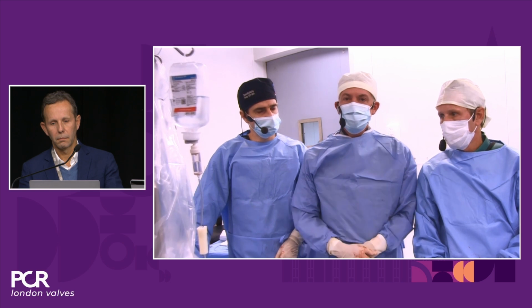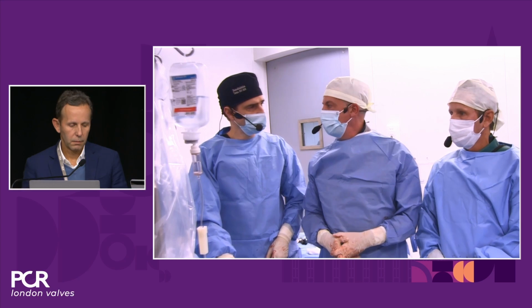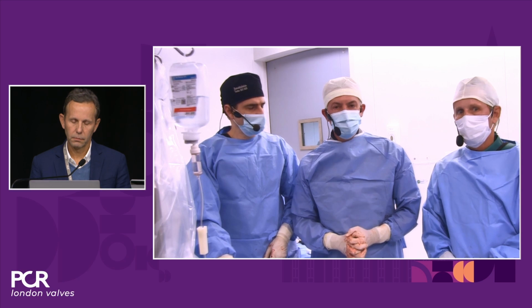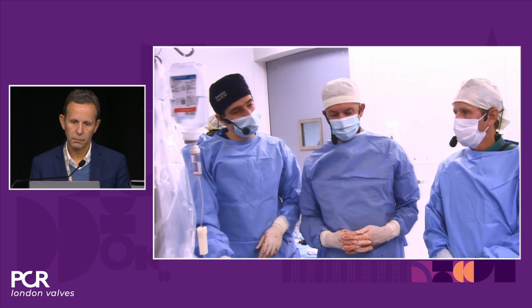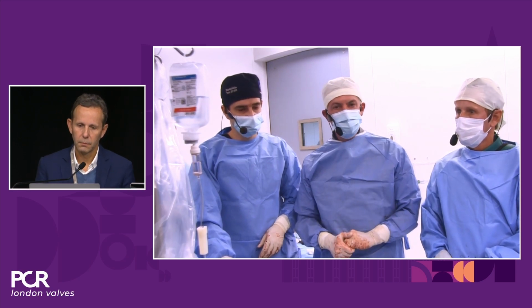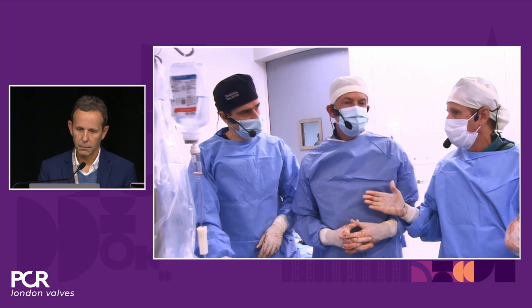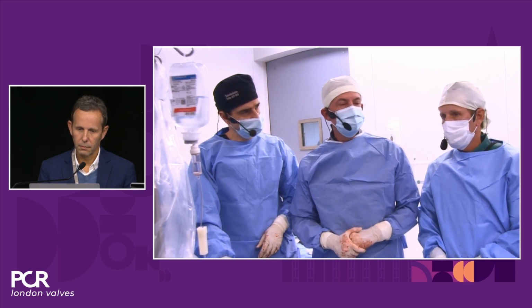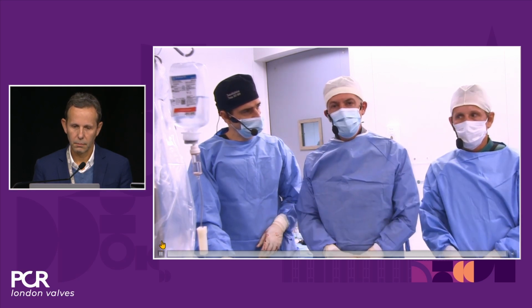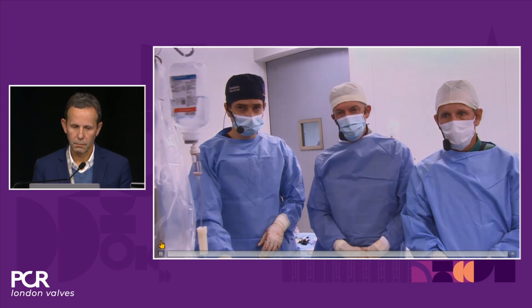And I have to say that this was a great demonstration. This is a very high-risk patient, right? With multiple manipulation, pre-dilatation, valve deployment, post-dilatation, and a good indication for the use of filter. Valve recapture. Exactly. So a lot of calcium manipulation. I think that we should be happy with the result. And at first, totally with zero contrast at all, right? We didn't use any. So two interesting protocols with cerebral protection and zero contrast. With that, I appreciate the help of everybody here at INCOR, the filming crew, echo, anesthesiologists, and the industry partners. Thank you so much.